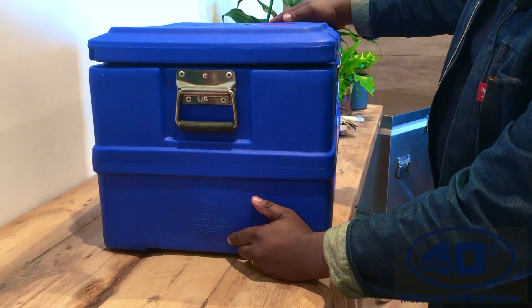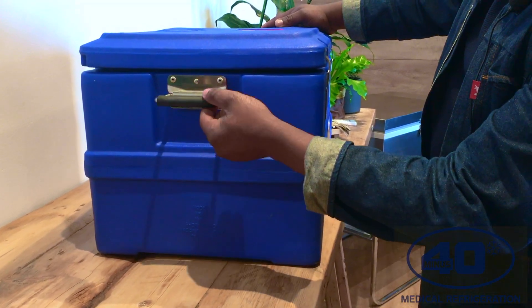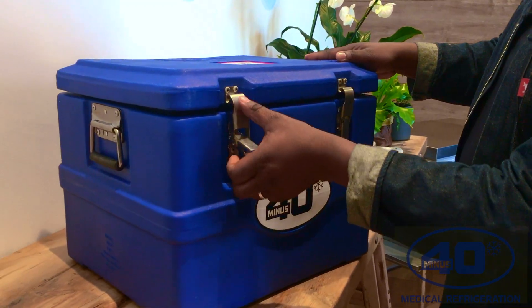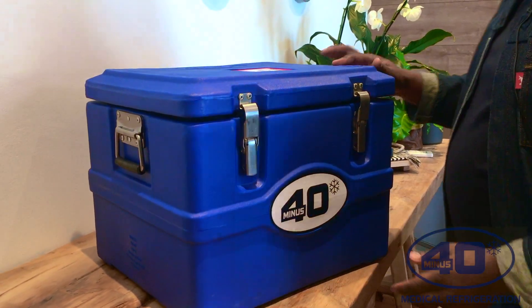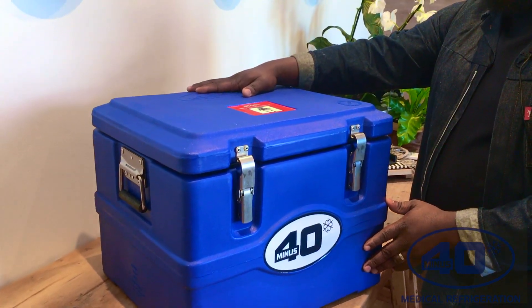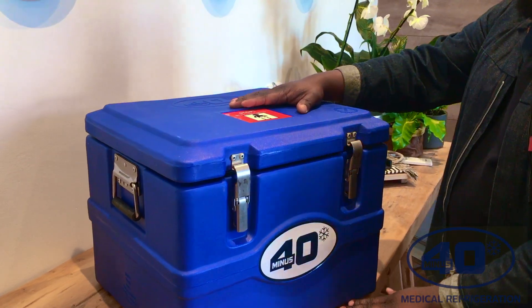And then what you're also going to see is the stainless steel handle that we use. We also use stainless steel latches as well. And then we have our minus 40 logo here. It also features right there on the top.